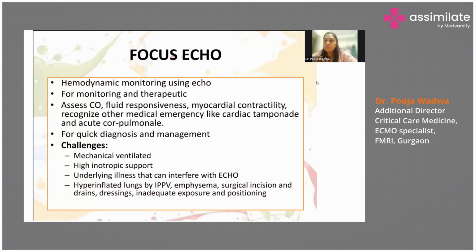First is echo. Echo, as we all know, has always been the domain of a cardiologist, but it is replacing cardiology in ICUs very rapidly, as more and more intensivists are showing interest in doing echos themselves, because cardiology is not always available 24/7 in smaller setups.